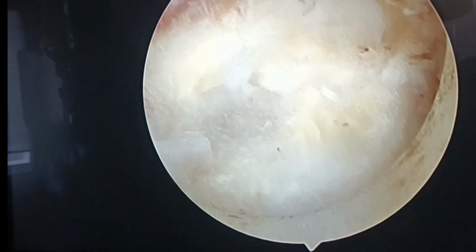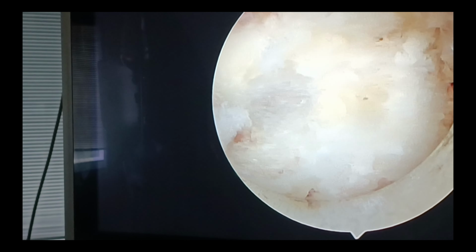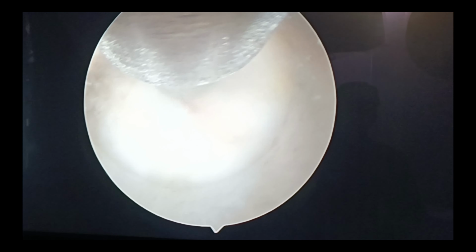So once we start drilling, we start from the IAP, then we go cranially towards the inferior part of the lamina of the superior vertebra, that is D10's lamina.